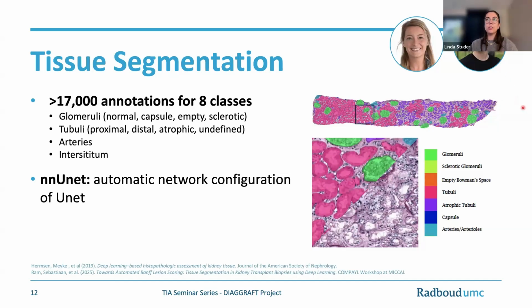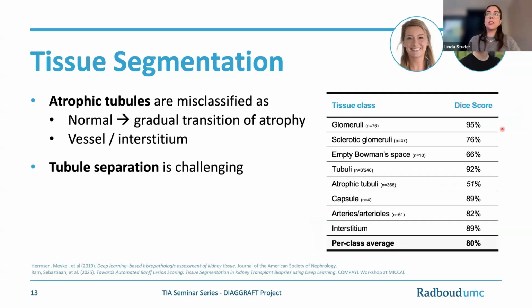I had a master student last year take her model and her annotations and bring them up to more state-of-the-art networks. He ended up comparing 2 different networks, but what we ended up with is an nnU-Net, which is like a U-Net but does automatic network configuration. And we saw really nice results for him.